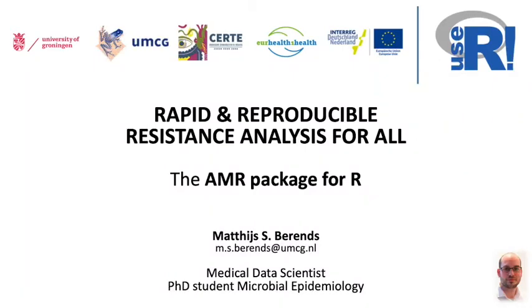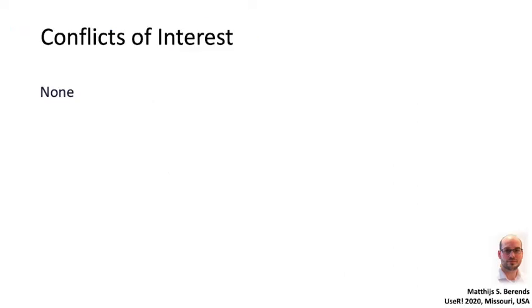Berends from the Netherlands, and I'm going to talk about rapid and reproducible resistance analysis for all using the AMR package for R. I have no conflicts of interest to declare.